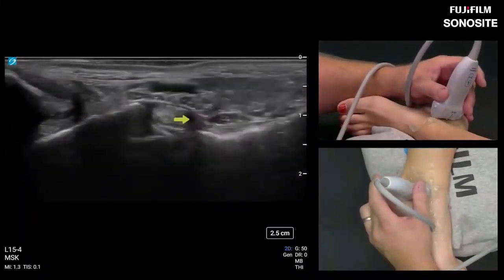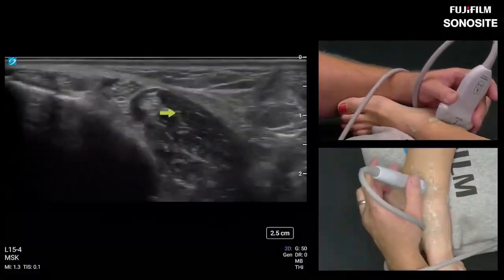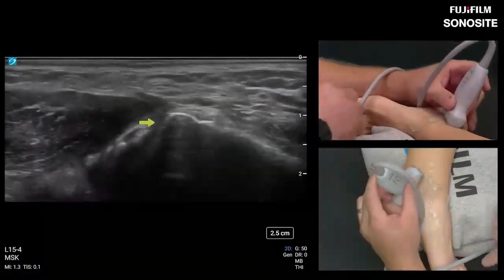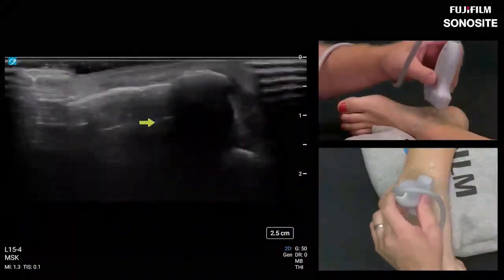So the musculotendinous portion was right here. Don't confuse this far distal muscle belly for a tenosynovitis. For one, we can go long axis on that and see if it moves. So starting on that, let's watch them all move real quick.